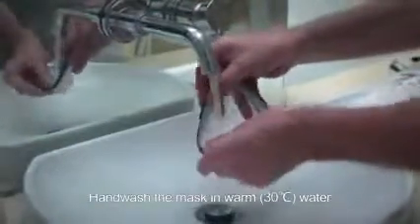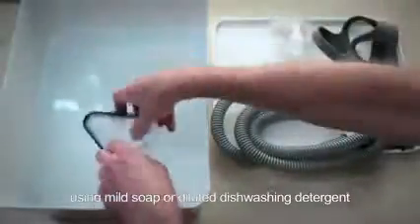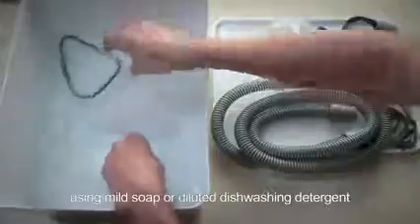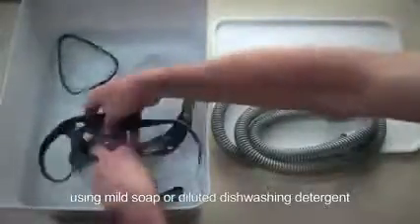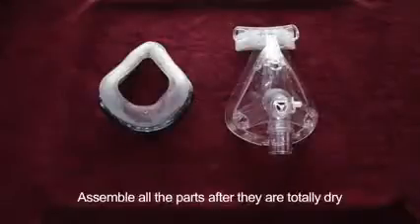Wash in 30 degrees centigrade water using mild soap or diluted dishwashing detergent. Air dry all parts out of sunlight, then assemble all the parts after they are totally dry.